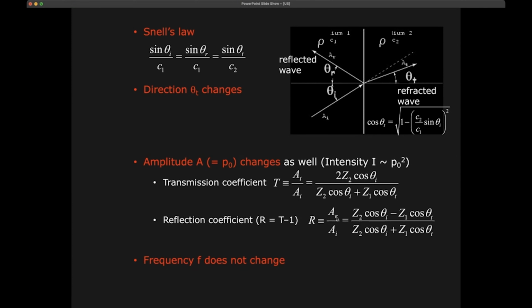And one is that if we have a change in medium which is much, much larger than our wavelength, so we go from one organ to the other, like really big organs, what we will have is specular or mirror reflections. And this is what happens traditionally at the mirror also. Right? So you know from physics what's happening with light at the mirror. It's exactly the same with acoustic waves. So electromagnetic and acoustic waves behave the same when we talk about waves.